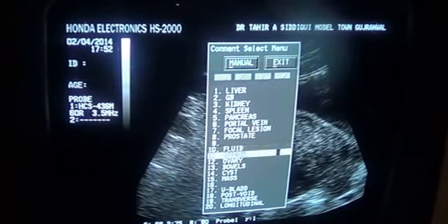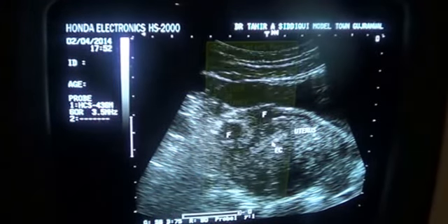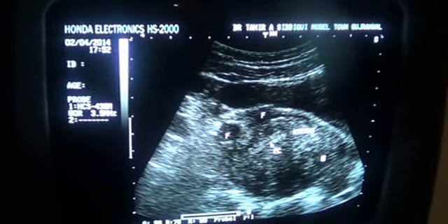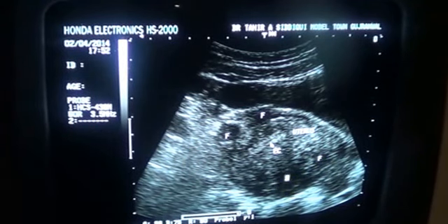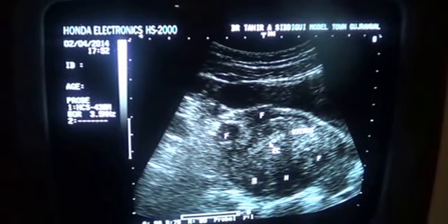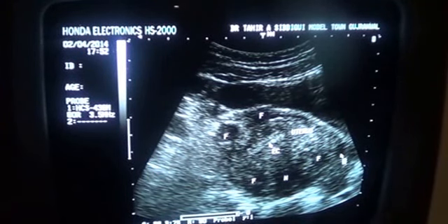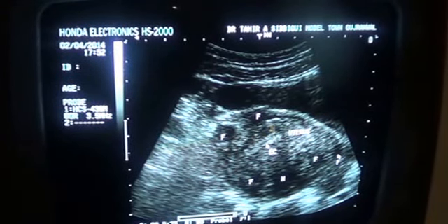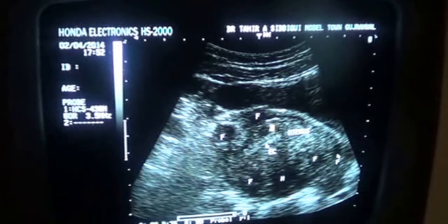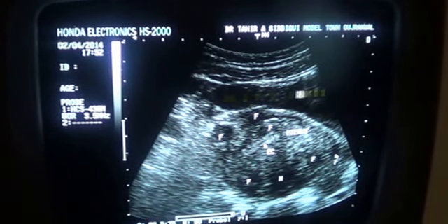This is the uterus. This is all uterus. You can see a few others in the posterior wall, as for example, this is a fibroid. This is a small fibroid, black and hypoechoic. This is again a fibroid. So multiple fibroids. This is also a small fibroid, subserosal in location, and this small rounded hypoechoic area is also a fibroid. None of the fibroids is having any effect on the central clear endometrial canal. And this is the urinary bladder.